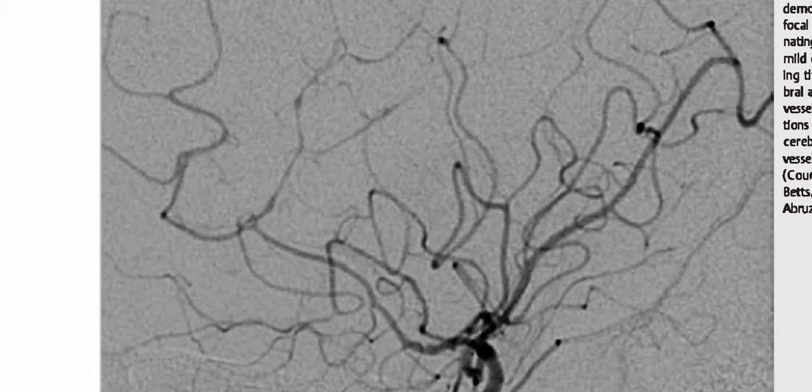So this is an adult patient who presented with headaches, and this is the lateral projection from a digital subtraction angiogram with selective internal carotid artery injection, and it is showing multifocal regions of stenosis and mild dilatation involving the anterior cerebral artery branch vessels. However, the visualized portions of the middle cerebral artery branch vessels are appearing normal.